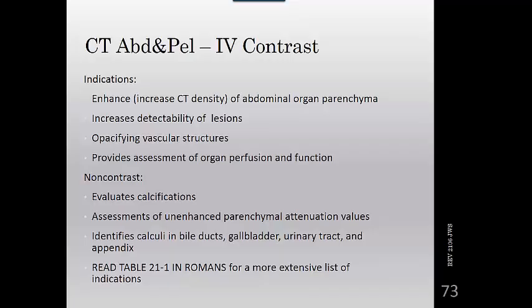The vagina is seen on cross-section as a flattened ellipse of soft tissue between the bladder and the rectum, and an inserted tampon will outline the cavity of the vagina with air density, and it's useful in identification of the vaginal canal. IV contrast agents improve the quality of the studies of the abdomen and pelvis by opacifying the blood vessels, of course.